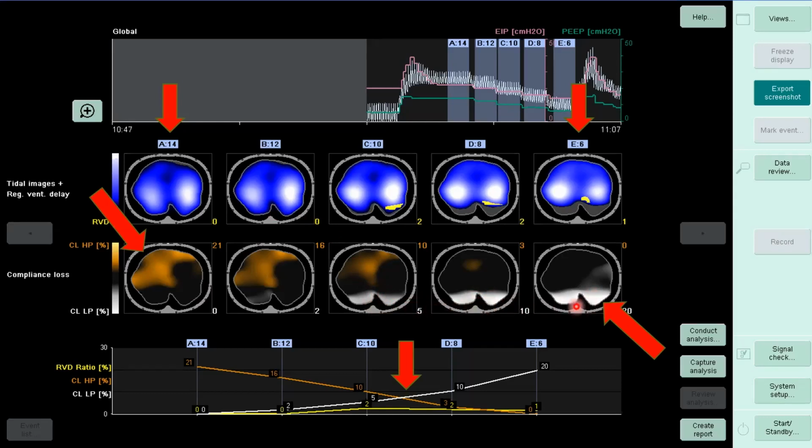So they suggest over here indicates the least amount of overdistension, the least amount of de-recruitment, but we still have to use our clinical judgment. And if you have a morbidly obese patient with pretty safe plateaus, perhaps you're going to go more between 12 and 10, perhaps 11 would be ideal. But in general, a good area is when they both cross, you're getting the least amount of issues.